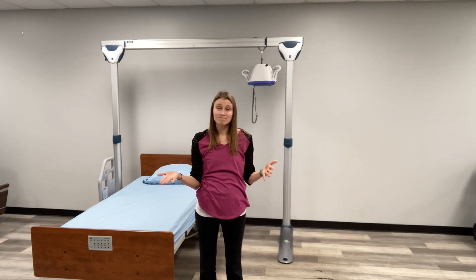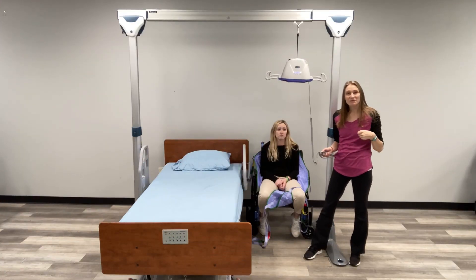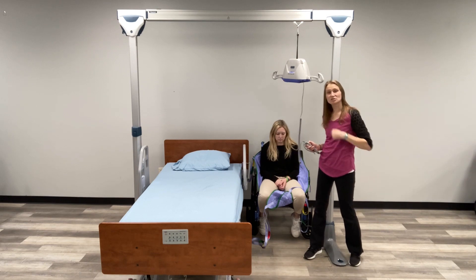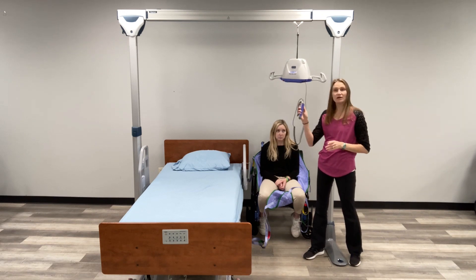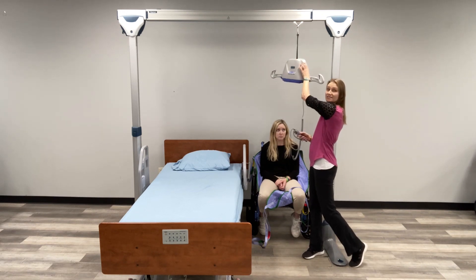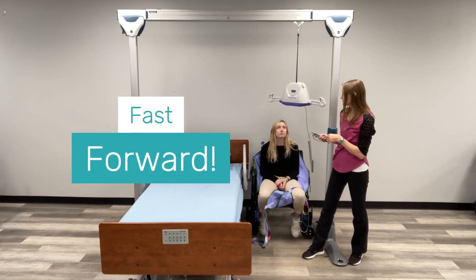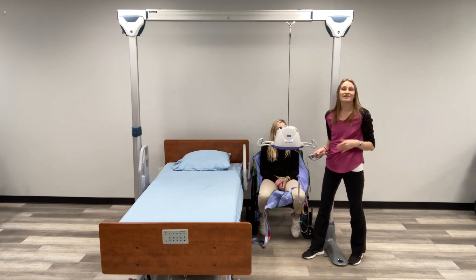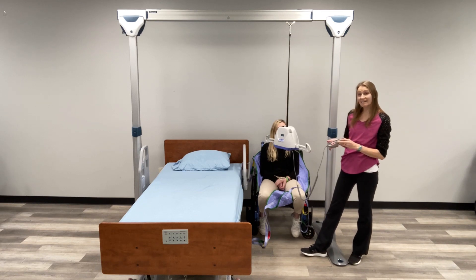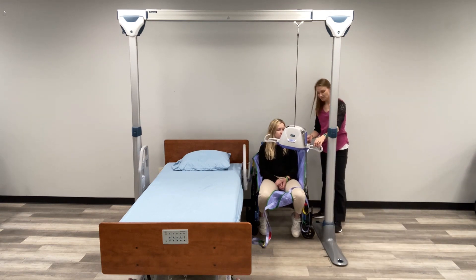The concept for all of them is the same. Let me show you on this model how it works. My client Morgan is set up and ready to go — she has the wheelchair parked right next to the bed and is already sitting on the sling. The first thing I'm going to do is use my remote control to bring the motorized unit down into place. Now that the unit is in place, I'm going to go ahead and connect the sling, starting with the hooks behind the shoulders.